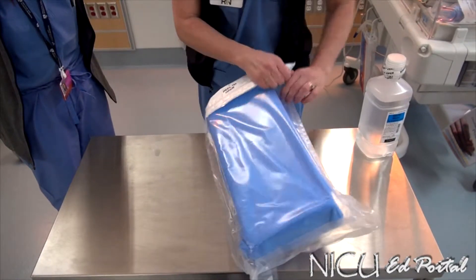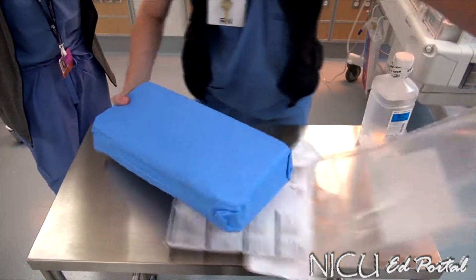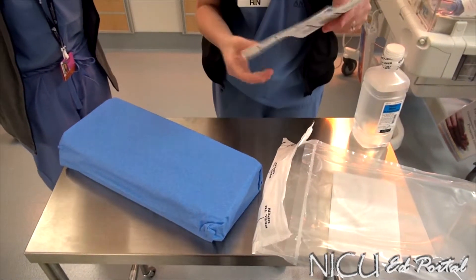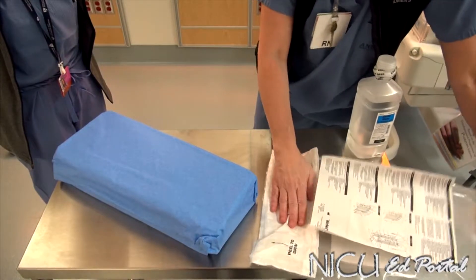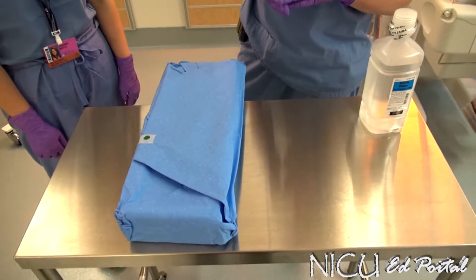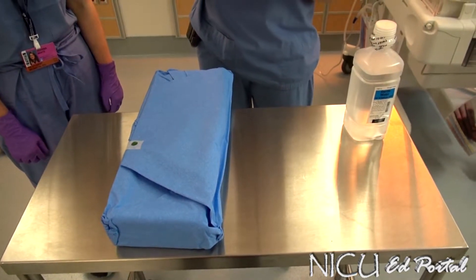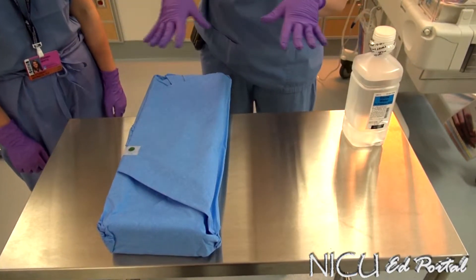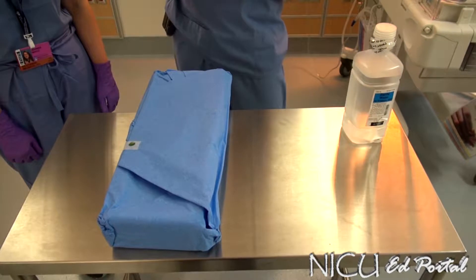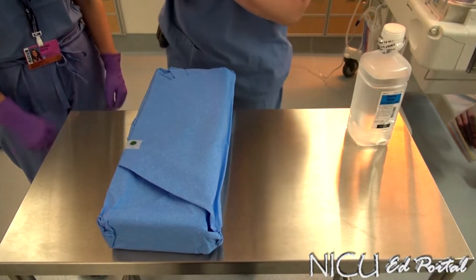On the back, you can just peel to open. The insert will be here to identify each port and chamber, so it's very good to get familiar with that. Now we're going to open up our Plurvatch system and go through setting it up. Like any procedure, you want to make sure you have performed hand hygiene and are wearing gloves — this is a clean technique. When connecting the chest tube set up to the baby's chest tube, that tip is sterile.